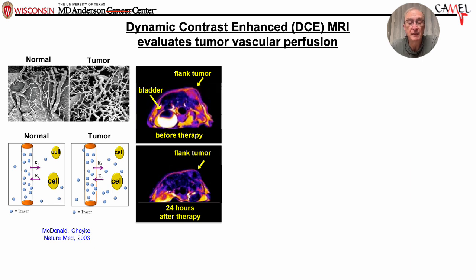It allows contrast agent to leak out into the tumor and cause the tumor to be bright in a T1 weighted MR image, as shown in the top middle. After giving a drug therapy, you can see that the bottom middle image is then much darker, has a black hole in the middle showing no vasculature, and showing antivascular effects for this particular treatment.